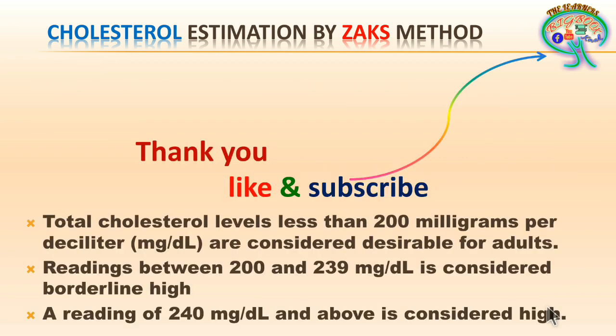Now coming to the little discussion part, total cholesterol levels less than 200 milligrams per deciliter are considered desirable for adults. When you give a blood sample for cholesterol estimation and get the results, this is what you have to be very careful with: if it is lesser than 200 milligrams per deciliter, it is considered desirable for adults.